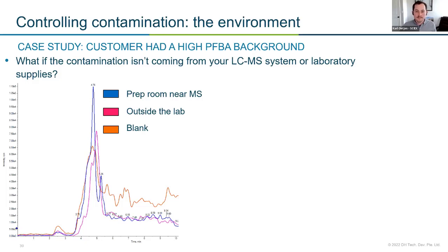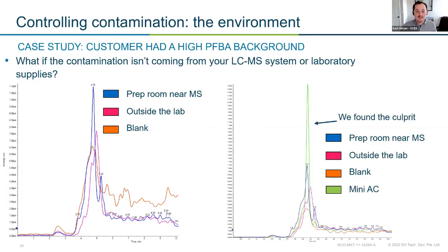Let's continue on. The customer at this point mentioned that previously when I'd been there, it was extremely hot in this lab. They were using those small window unit ACs, and they decided to switch over and get a mini split. But when they installed it, it was December, and they didn't use it until recently. That threw on a light bulb for both of us, and we said, oh, we should definitely swipe that mini split. And what we saw was, yes, it was coming from the AC.